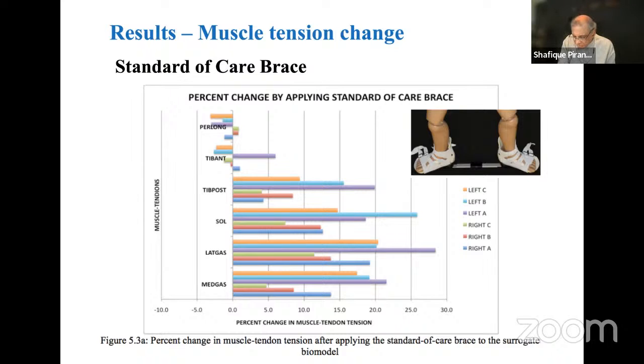In fact, I've tried to have that discussion with the brace designer, that for unilateral club feet, the normal foot needs only to go in at 30 degrees. When I was doing my work in Bangladesh, I would advise the doctors in Bangladesh and also in Uganda, where this brace was originally designed, that in the unilateral case, because the bar is only 6 millimeters cold iron, it's malleable, it's bendable. So you can put the bar over your knee. The doctor can do that and reduce the 70-degree abduction to 30 degrees. Is that the question you're asking me?